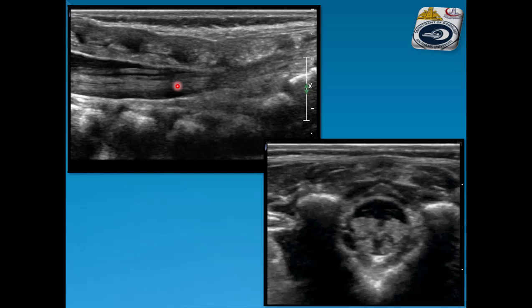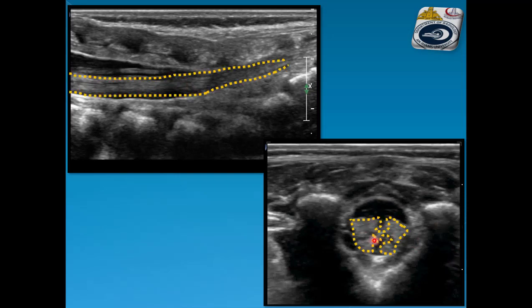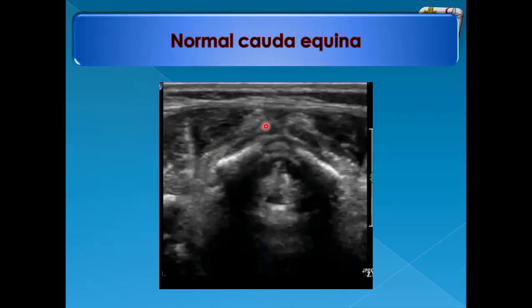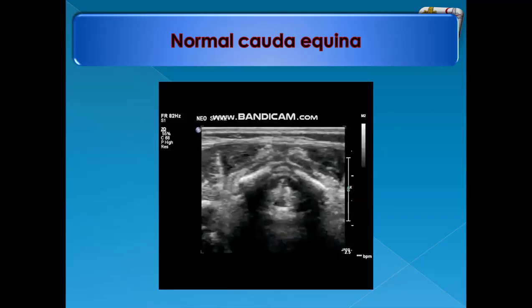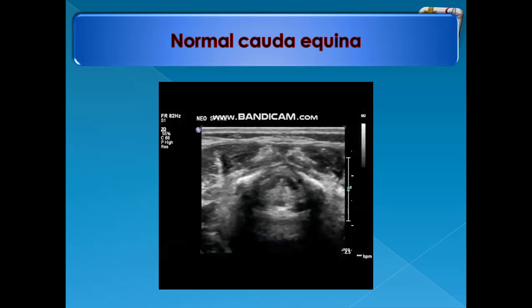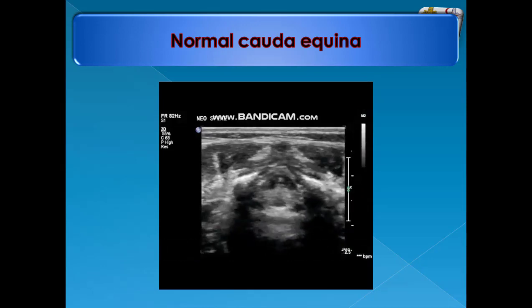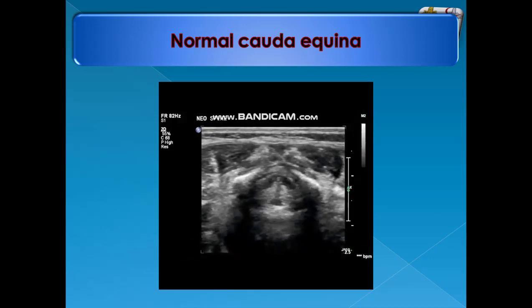This is the normal appearance by LS — in the dependent part of the spinal canal, this is the cauda equina. By TS, this is also the cauda equina. The oscillatory movement with cardiac pulsations and respiratory movement is very clear in this video.